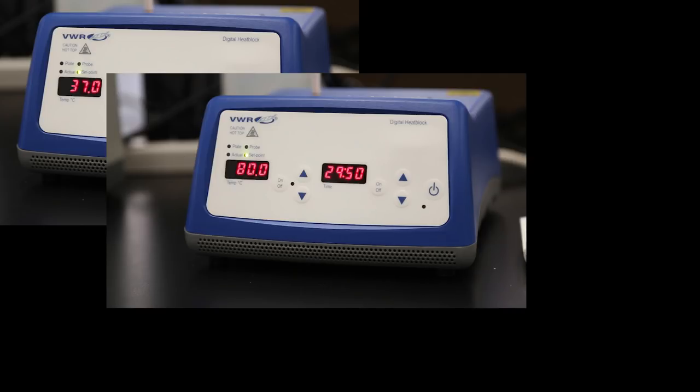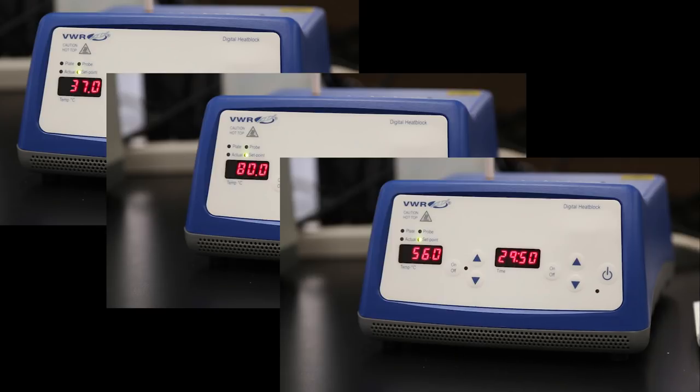If you are using three single blocks, set the first to 37 degrees Celsius, the second to 80 degrees Celsius, and the last to 56 degrees Celsius. Remember, the green light must be on for the block to heat.